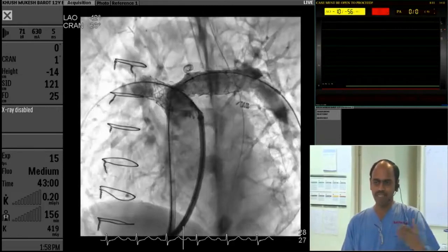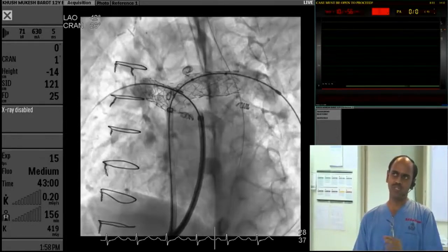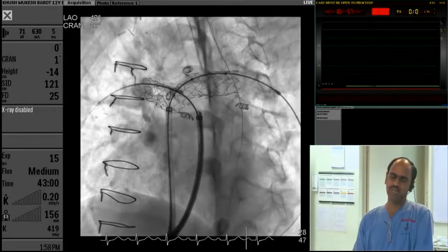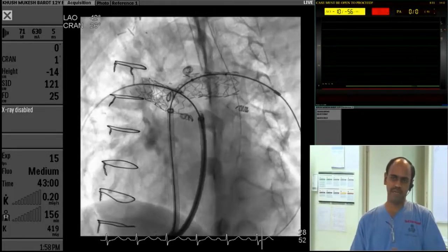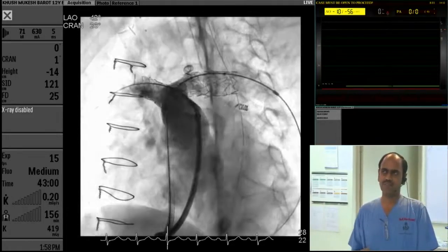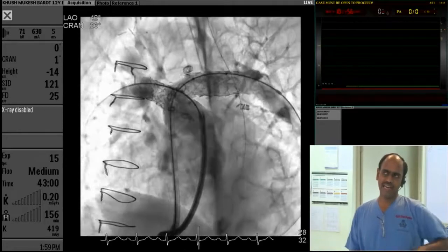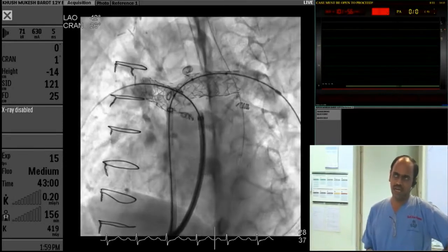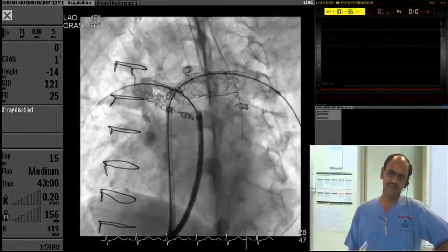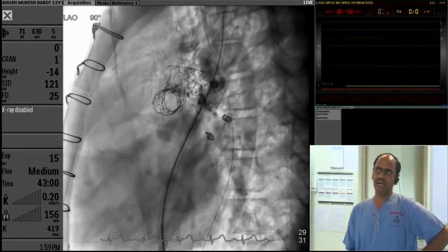At this part, I stopped the transmission because time was running off. The intention was to pull out both wires and have one sheath going through the superior vena cava to prepare for a superior vena caval stent. We had already done an angiogram showing a short segment — about 10 to 12 mm stenosis — at the SVC-RA junction where the SVC was reconnected to the right atrium. I pulled the sheath up to the right atrium and advanced the guide wire superiorly towards the superior vena cava.